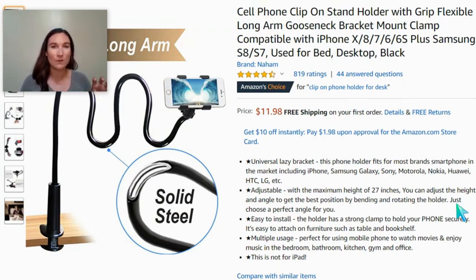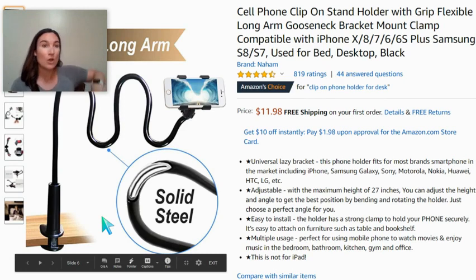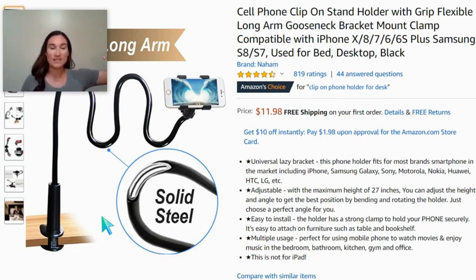There's a bunch of different ones on Amazon that one end will clamp to your phone and the other end can clamp to a table, or you could put it onto the back of a chair so that it can come up around here, have a really nice view of the AAC system and your hands activating it, and then hopefully not be in your way. So like I said, there's a bunch of different options on Amazon. What you're going to want to search for is the word gooseneck. So this gooseneck clamp and a bunch of relatively inexpensive ones will come up.